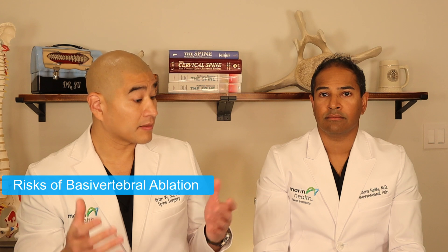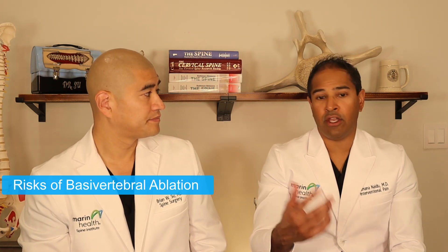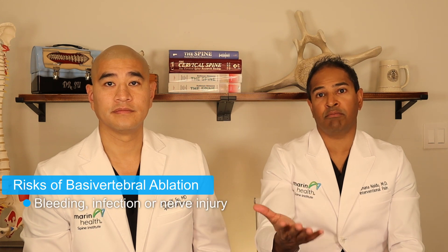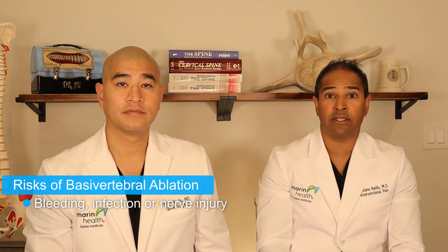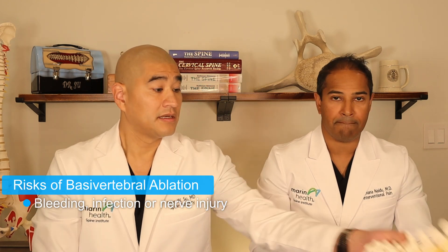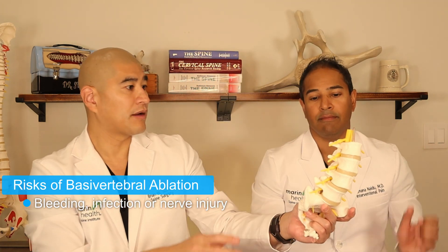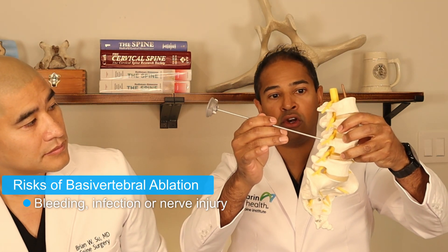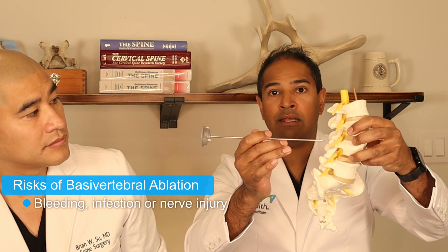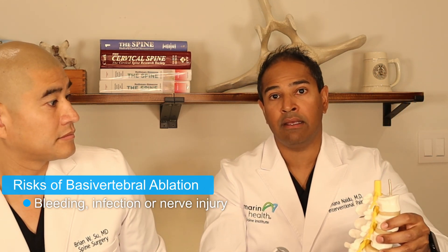There are always risks and benefits with any spine procedure. Anytime we introduce a needle into somebody, we talk about risks of bleeding, infection, or nerve injury. Bleeding and infection are extremely rare in this procedure. Nerve injury does happen, however — we suspect that on occasion when going through the bone, the specialized needle or trocar slips off, goes too low or too far inside, and may irritate the nerve that comes from the spinal canal down to the leg. Some people will have temporary leg pain as a result.